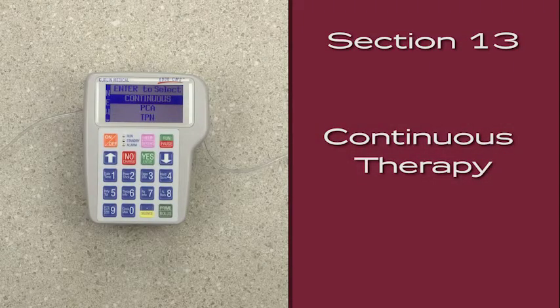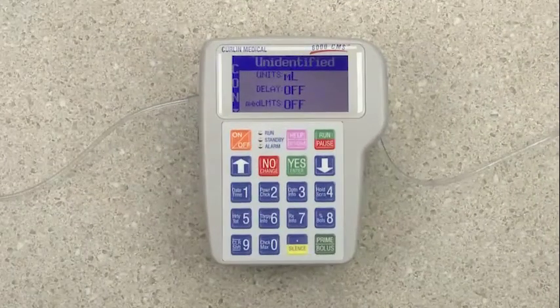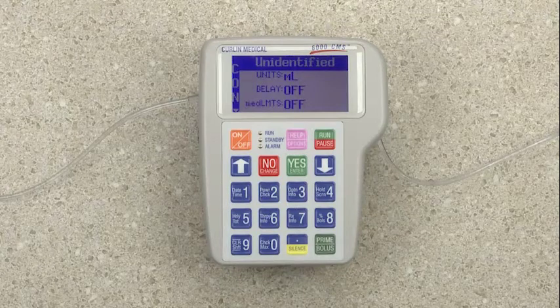Continuous therapy. Now we are going to cover the continuous therapy. So cursor back up and highlight the continuous mode. Press the Yes key. If there were previous prescriptions in the pump, say yes when the pump asks if you wish to continue and erase the previous program.